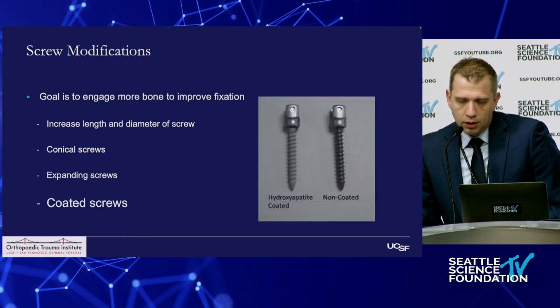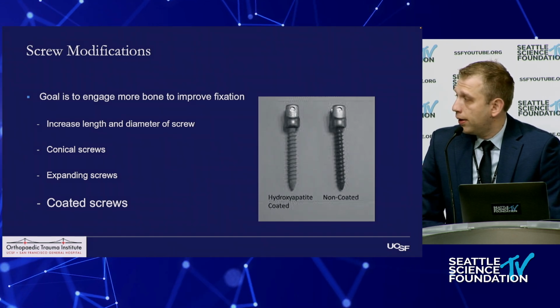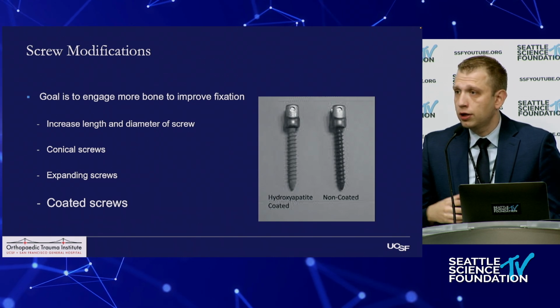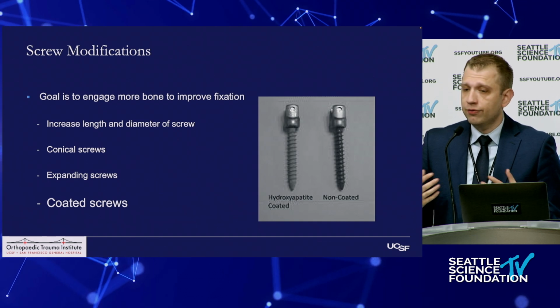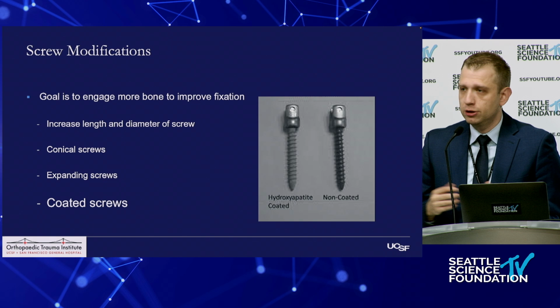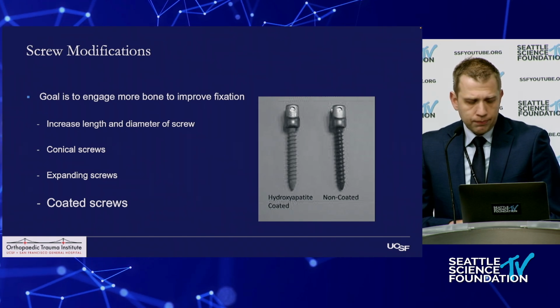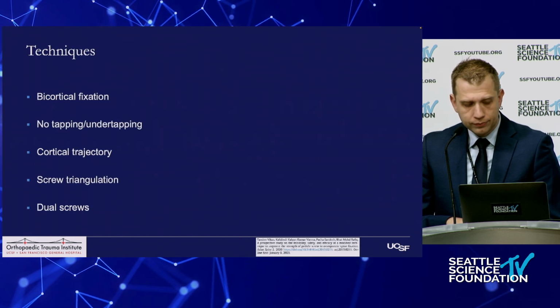And then another option, which isn't available at all places, but is also interesting, is your coated screws, which help fuse to the bone. But again, if the patient has bad bone, even if it fuses to the bone around it, it may just break through it. So now I'll proceed and talk about some of the techniques that are out there.